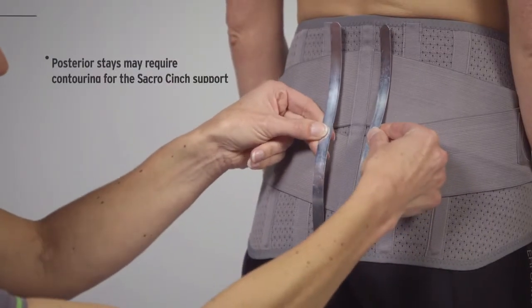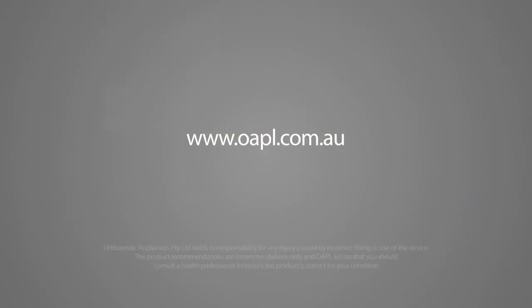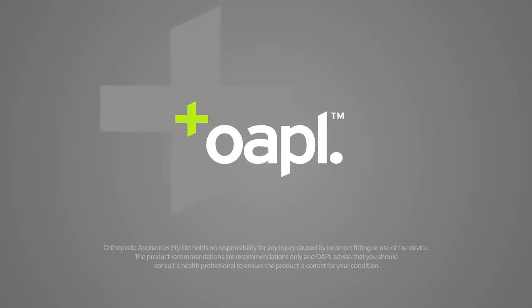Posterior stays may require contouring for the sacro cinch support. For more information and care instructions for the OAPL range of back supports and our entire product range, visit the OAPL website at www.oapl.com.au.